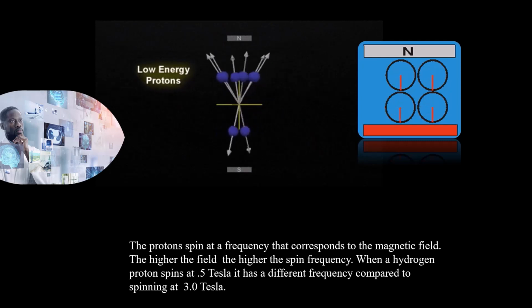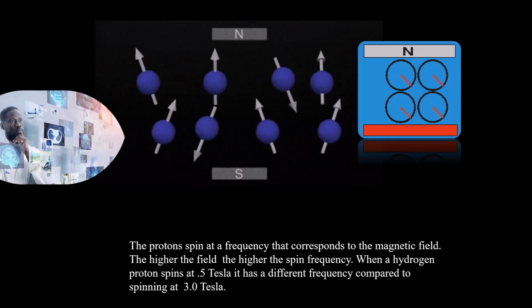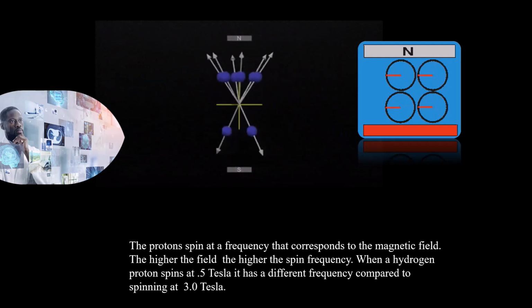Now we're going to move forward and we're going to look more in detail at the utilization of radio frequencies and magnetization.